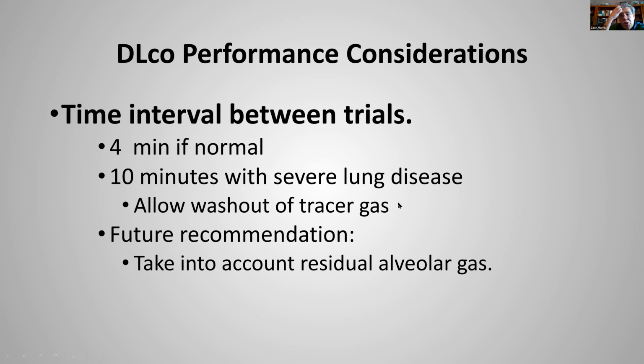Okay, when you're performing diffusion, this becomes important. The time interval between trials should be 4 minutes if you're normal, to allow adequate washout of the methane, the tracer gas. Okay. If you have severe lung disease, you should allow 10 minutes. Now, the problem is though, if we're only allotting 15 or 20 minutes to perform a diffusing capacity, that sometimes doesn't allow you more than just 2 tests. You spend a few minutes doing the first one, you wait 10 minutes, do another one. So quite often that period is not waited, with the technicians when they get pushed.